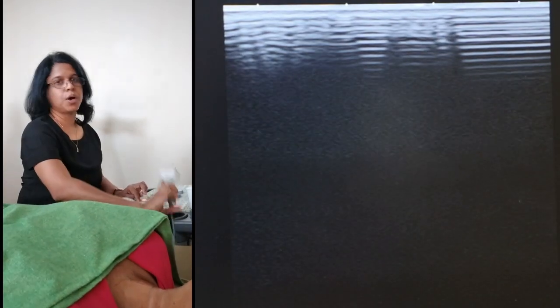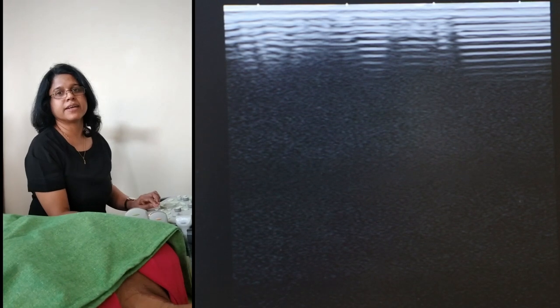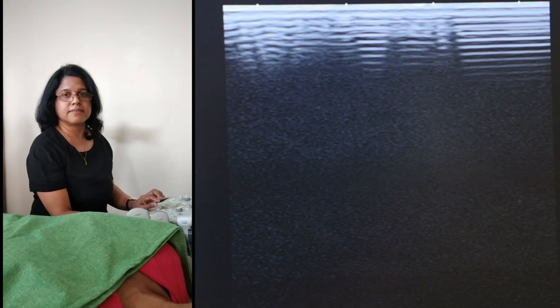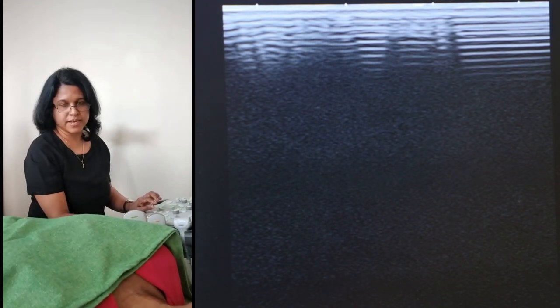So today I have shown you how to do a thyroid gland ultrasound and what are the structures we can identify in the neck ultrasound. And as this is a normal scan, I could not demonstrate any pathologies.